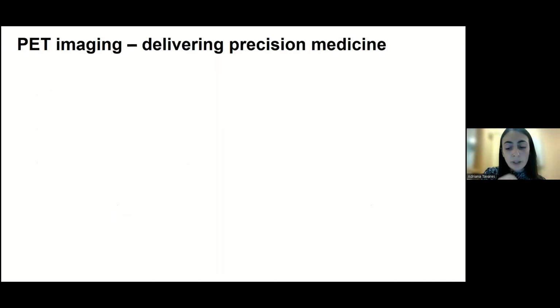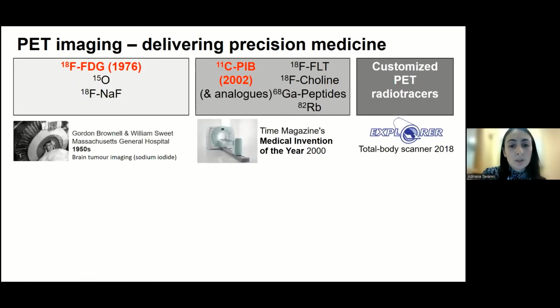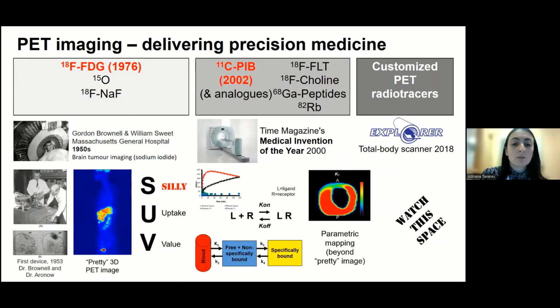So just a bit of a recap. PET really is that tool that will allow us to deliver precision medicine, and we do that with three layers. The first is we need to have a radio tracer, and we talked about that already. It's a bit like a contrast agent, but with a radioactive isotope. We also need very good instrumentation, and as I mentioned, the development of the total body PET scanner for humans is really impactful because we can now look at the whole body in just a few seconds, which is absolutely amazing. But we also need another layer, which is image analysis. I gave several examples of kinetic modeling before and what that entails, but there's a lot more to be done in this space. So really watch this space for more updates as we progress.